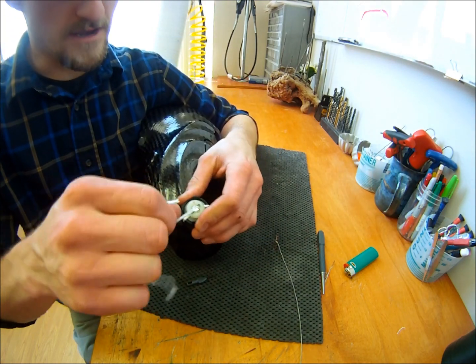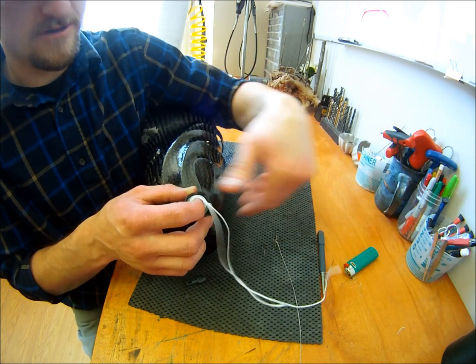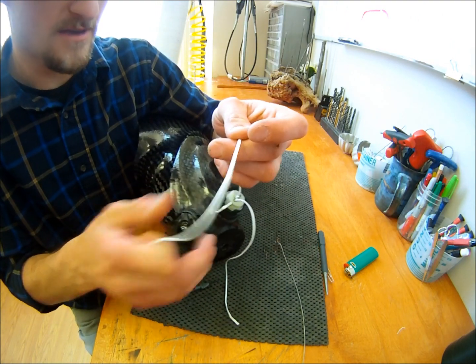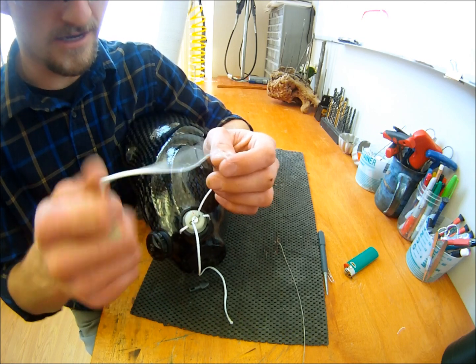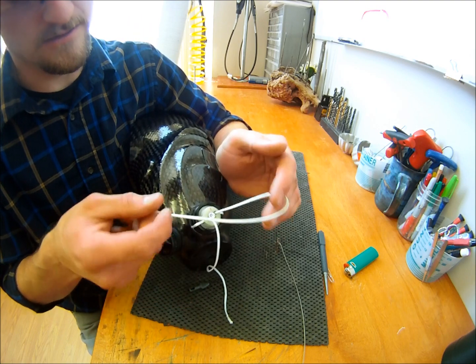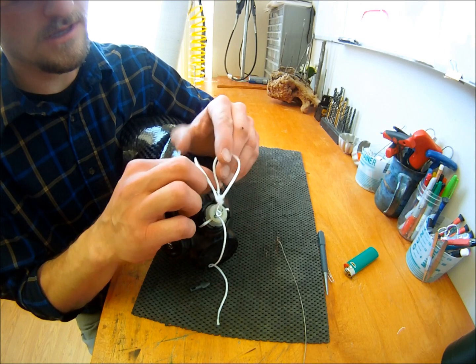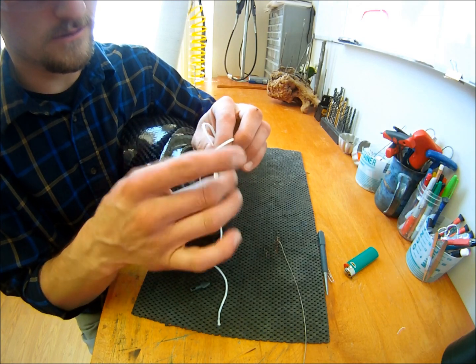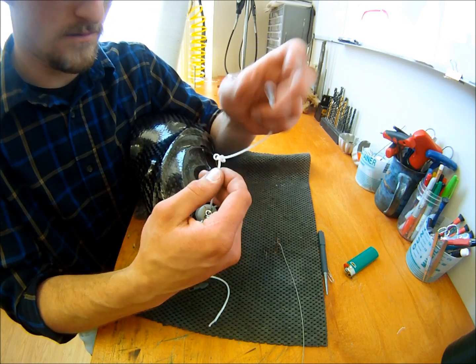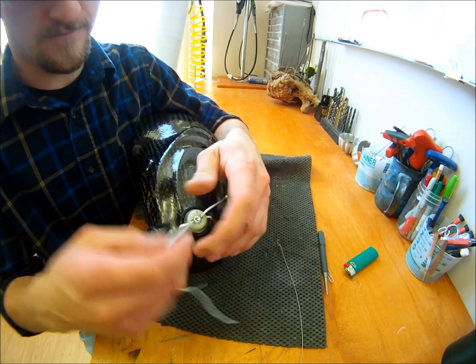Okay, now you can lay your dial down flat upside down. Figure out, I typically leave about 3 to 4 inches of slack from the base to the knot. And you tie the knot by doing a loop, putting the spectra through the loop, and then through the loop one more time. So you'll end up with a double overhand knot. Do the same for the other side.